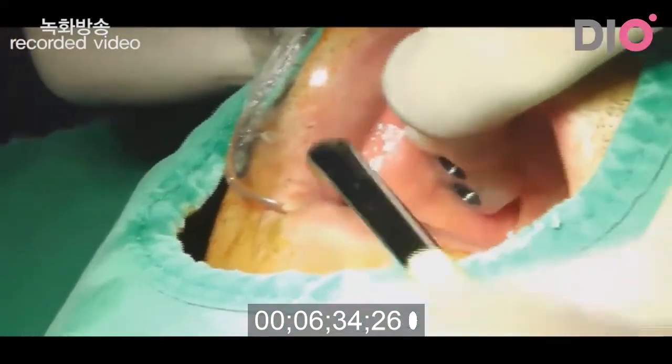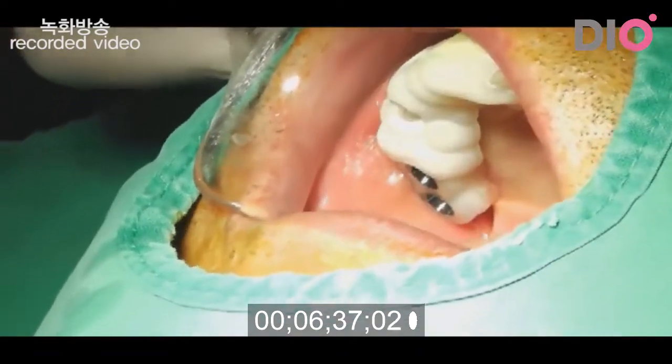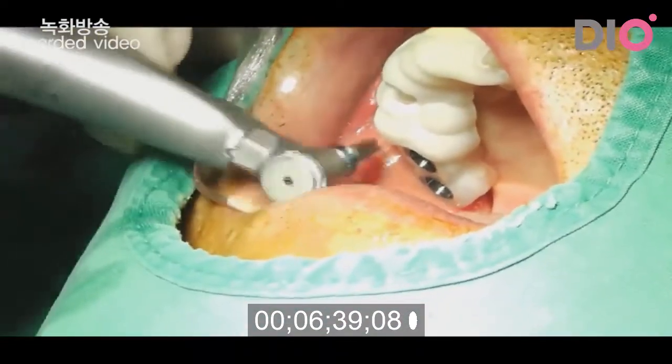And then, final drill. This is the final drill.